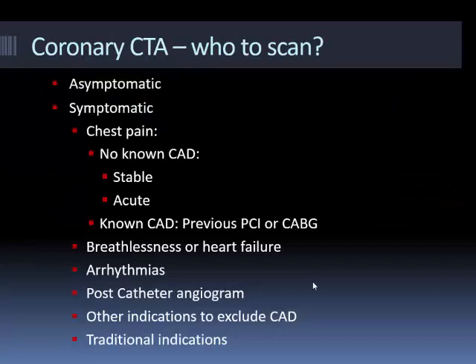So one of the first questions that you have to ask yourself is, obviously you've got this new technology. How are you going to use this technology? And probably the hardest question when you first start is, how are you going to use it together with the existing techniques that you've got? Obviously, most of you are in centres where no doubt there'll be either stress echo or SPECT or stress MR. And one of the questions that we always get asked is, how are we going to develop a service which isn't effectively competing with existing services?